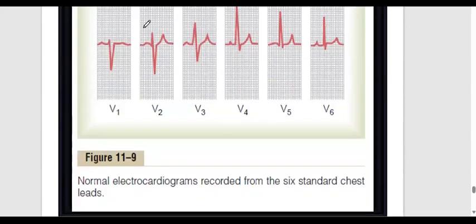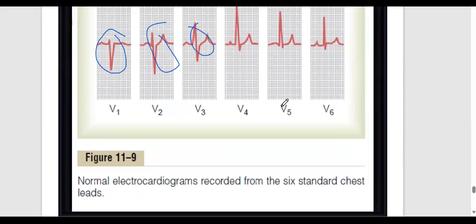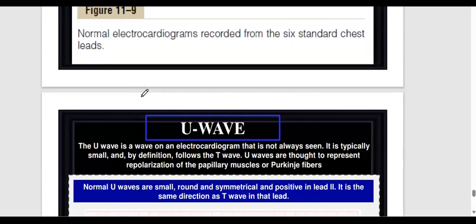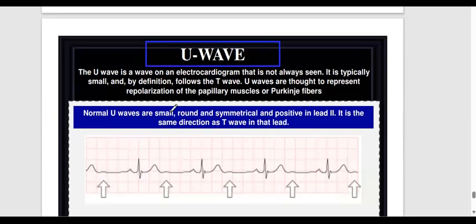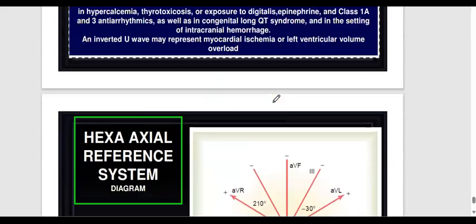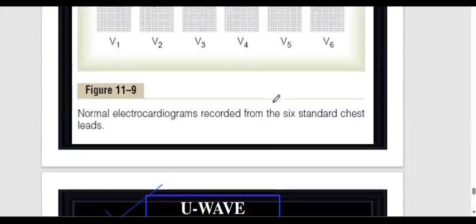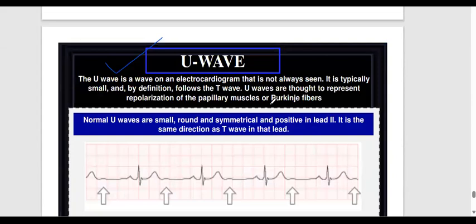These are the leads: V1, V2, V3, V4, V5, V6. From here we will discuss tomorrow, because we have only one thing left. So you have understood. Okay.